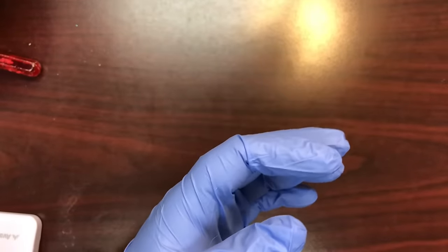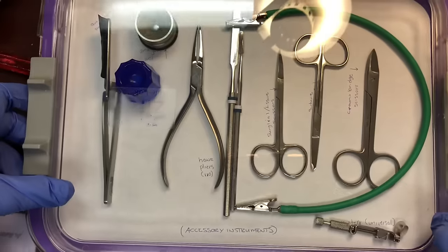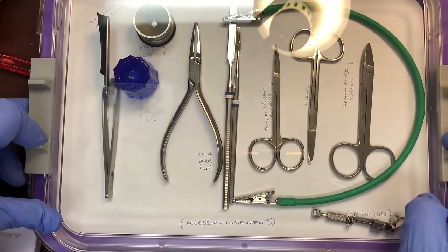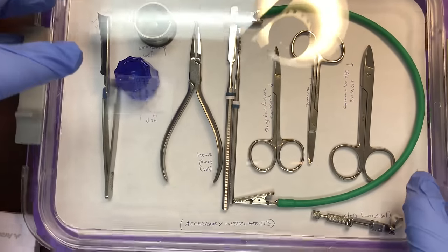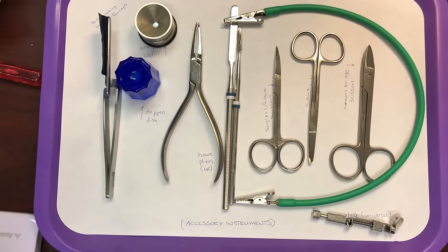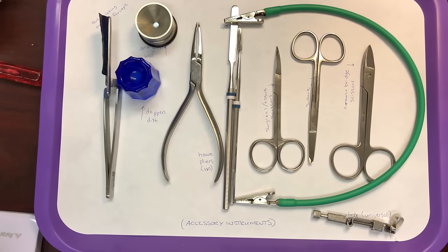The last tray we have contains accessory items. Accessory items may or may not be needed during the procedure, depending on the procedure — you would know ahead of time. If you're doing an amalgam, you'd use the amalgam well; if you're removing sutures, you'd have a suture knife. Accessories are added as needed.